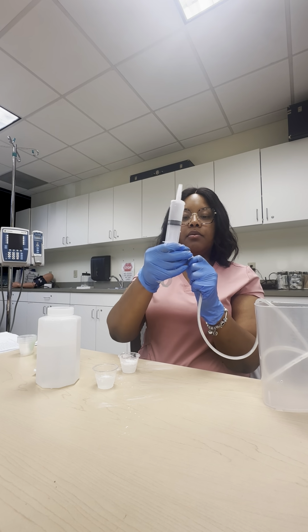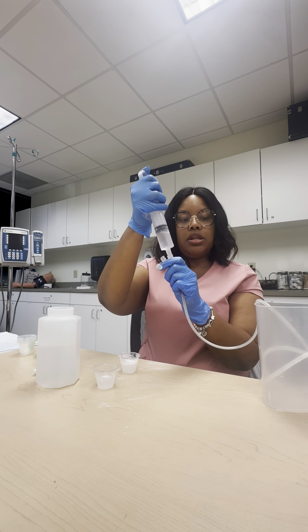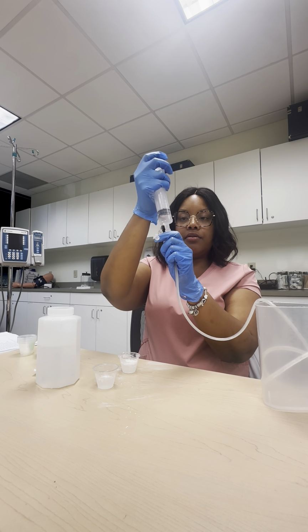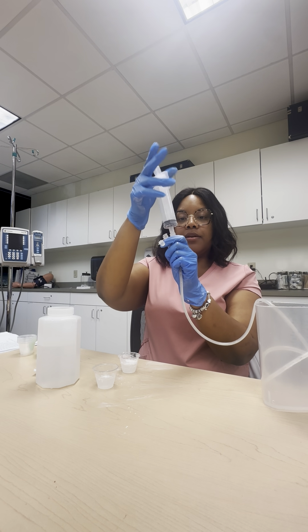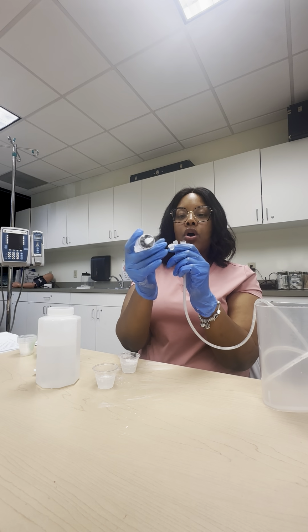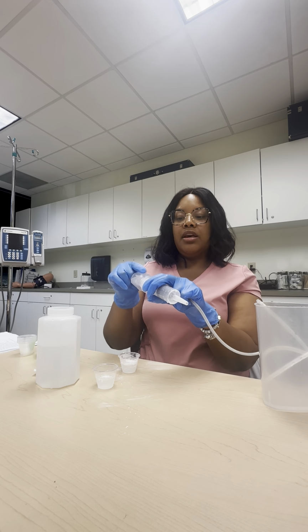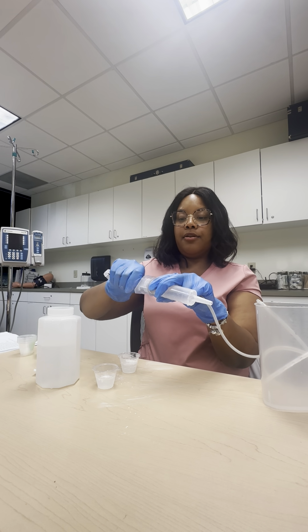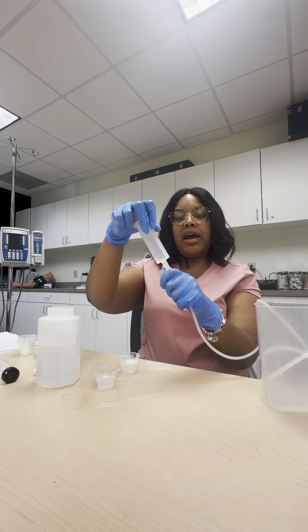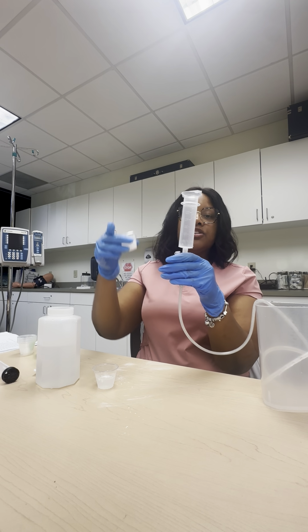All right, so then we will come back to your peg, and we will push it in there. And as you can see, it's going down, it's going down. After we flush with the 30 mLs of water, now we want to do everything else by gravity. So we want to take the plunger out, and then just connect here. This is by gravity. We're going to give our first medication because we've already flushed the line and it's good.